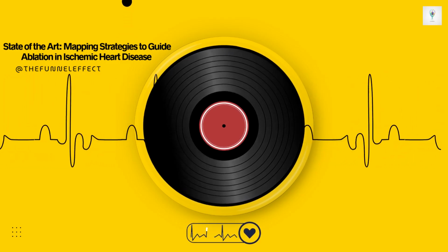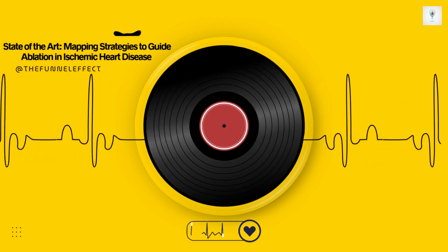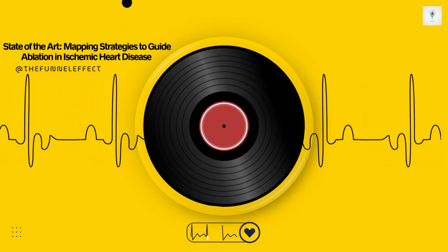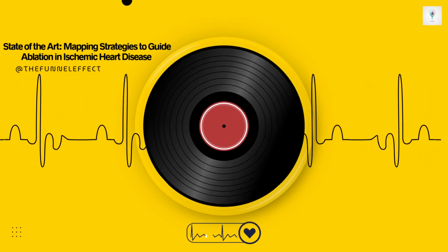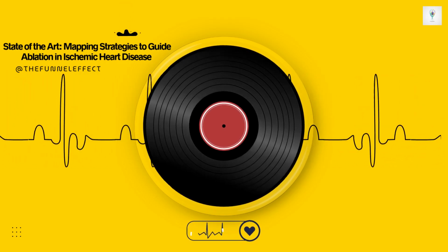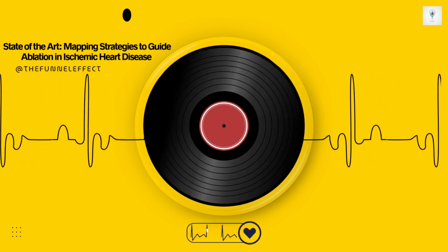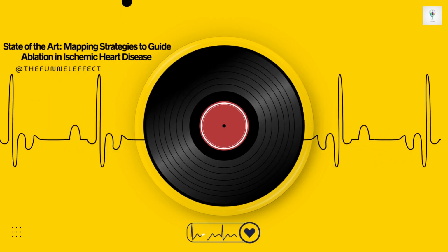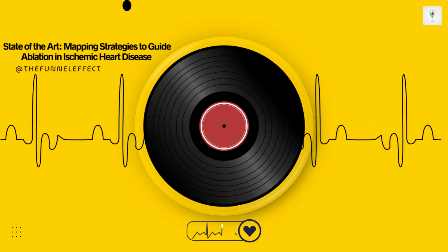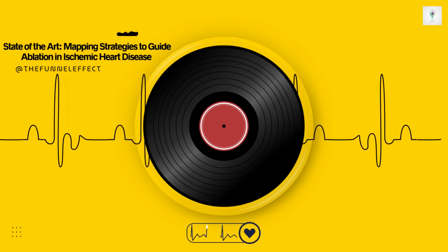Wow. So the surface reading can basically lie to you about what's underneath. Precisely. The bipolar signal is very localized. It doesn't see deep into the wall effectively. The studies comparing voltage maps to cardiac MRI are really striking. They found areas where MRI showed significant scar, maybe 25% of the wall thickness was scar, according to the LGE signal, but the median bipolar voltage on the surface was still 2.2 millivolts, way above the 1.5 millivolt cutoff. If you only ablate areas below 1.5 millivolts, you could be leaving behind critical parts of the reentry circuit hidden deeper in the wall. That's a huge deal.